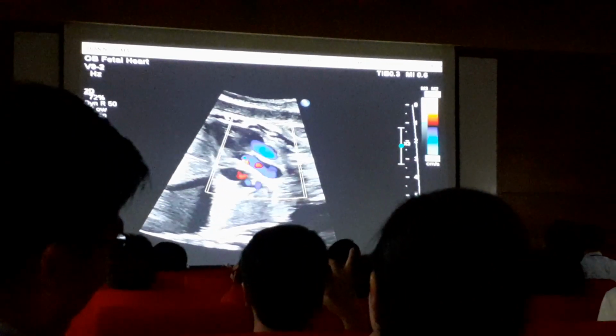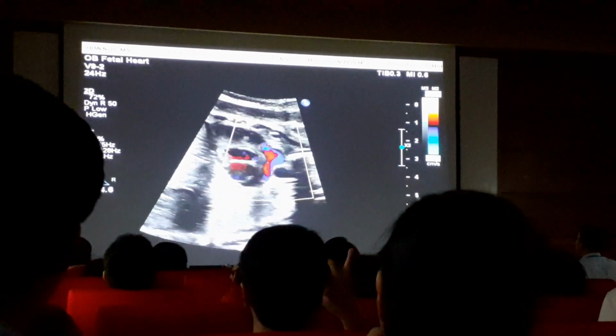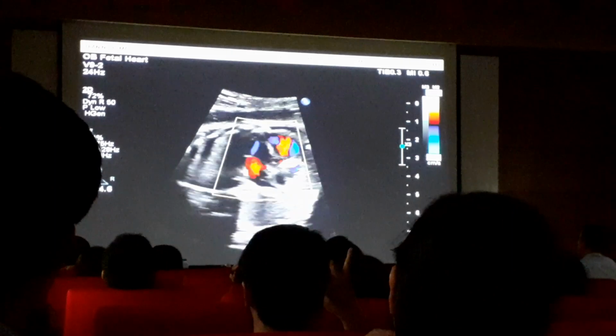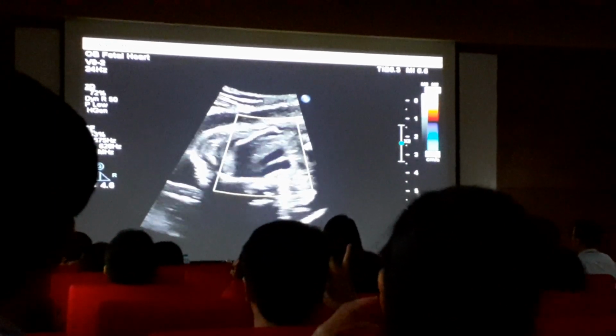Okay. So there's no pulmonary valve obstruction. I'm still looking for a reason for that high RV pressure. Ductal constriction would be on the differential. I think we already saw the ductal arch though, and it looked normal, so there's no ductal constriction there.